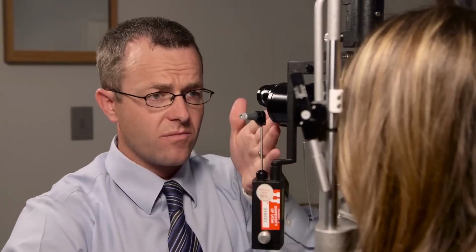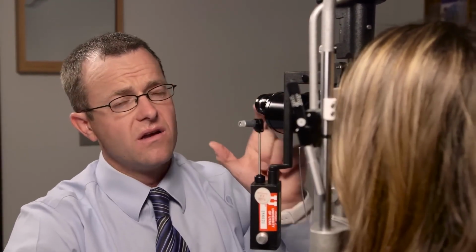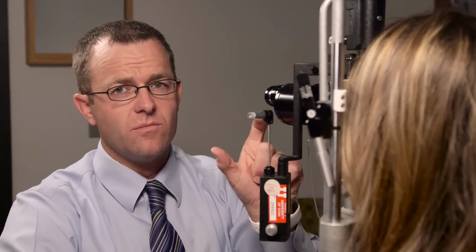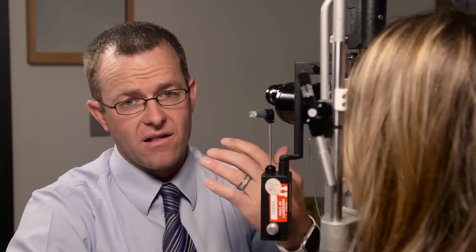First and foremost, I like to do my posterior segment exam using this 78 diopter lens, and I like to do it with my beam not shifted or slanted to one side or the other, but straight on. I feel like that helps me to focus it. Also, I make my beam a little bit taller and a little bit narrower. And then once I have the nerve and the blood vessels and the macula in focus, I'll change the size a little bit. I'll shorten the beam down and widen it just a little bit. That gives me a lit up area that's a little bit easier to see, and that'll help me to focus in on the nerve and the blood vessels and that sort of thing.